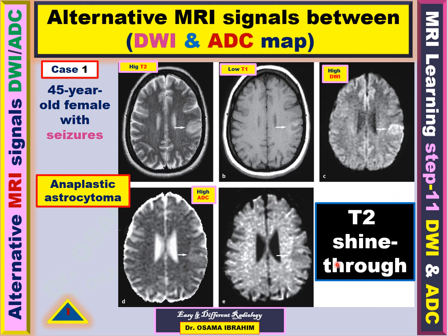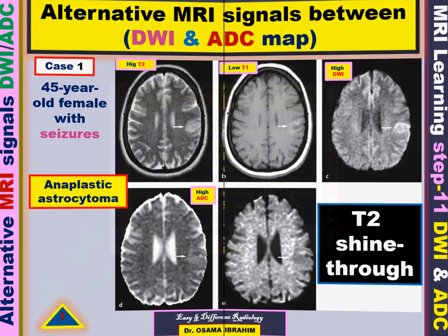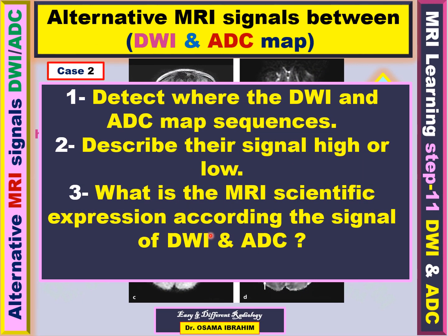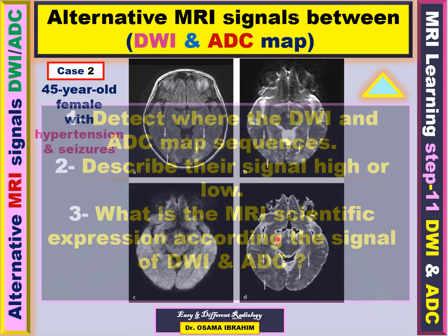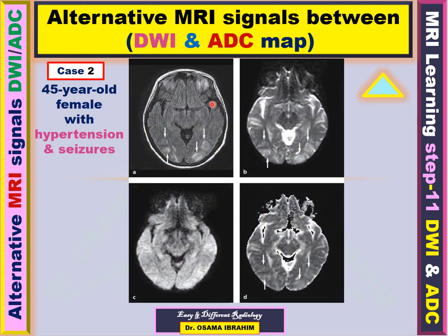The T1-weighted image shows white matter brighter than gray matter. This case was diagnosed as an anaplastic astrocytoma. The lesson today is how to describe T2 shine through and how to detect it from the diffusion-weighted image and ADC map. Next case — detect the sequence and signal within the sequence and describe its MRI scientific expression. The next case is a 45-year-old female with hypertension and seizure.